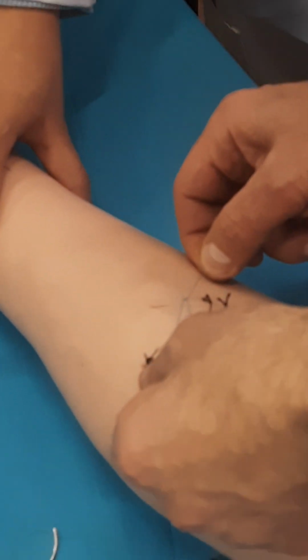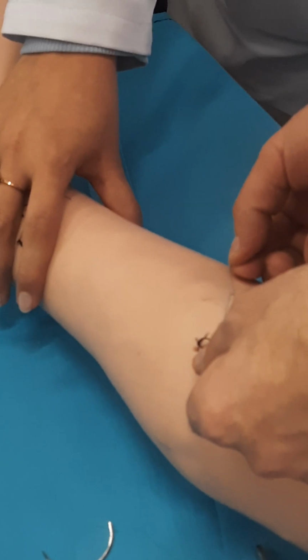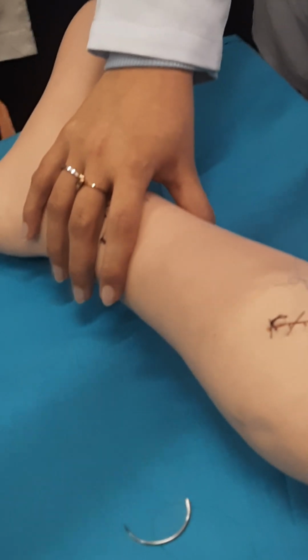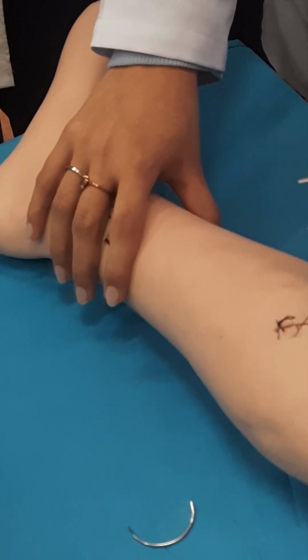You take, you make the knot. No, I don't want to tie it up to the finish because I will use it. And how many times? Usually 4, 5, because this is monofilament. For the polyfilament threads, 3 will be enough. Let's loosen it now. Yeah, and what after?